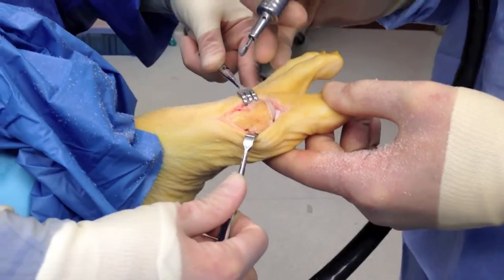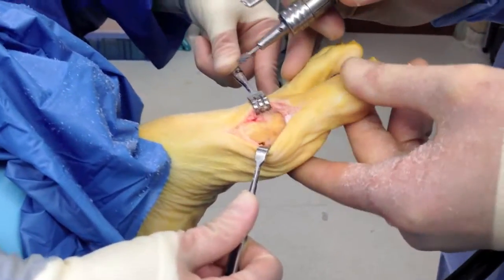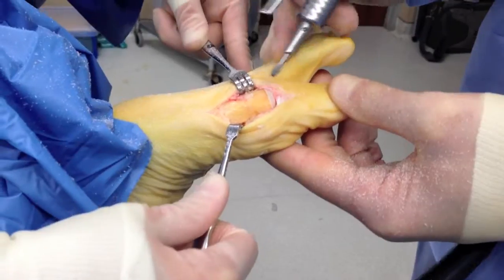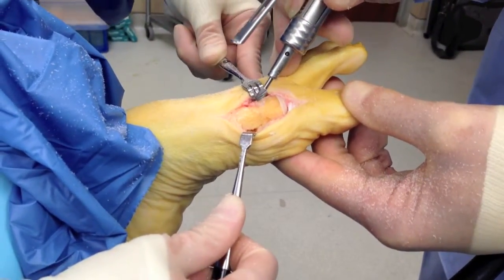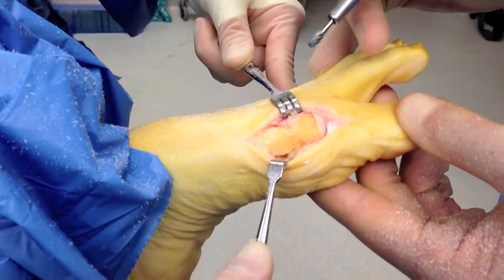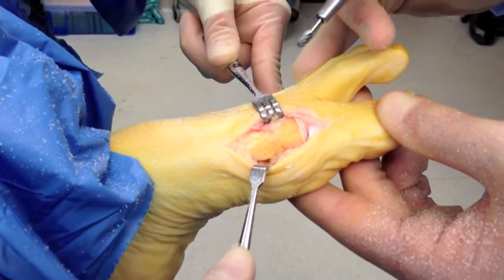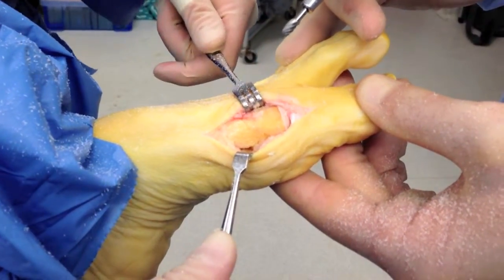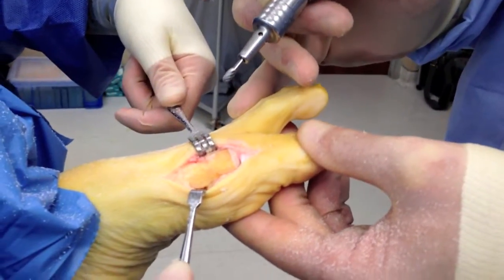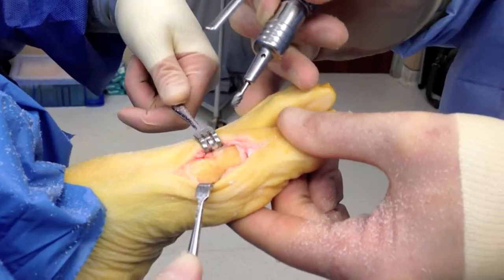Now what we have is the finished product. I've done all the burring. The osteotomy you can see is still down here, and the nails, which you can barely see, are here and here. Those will be absorbed into the bone in probably about six to eight weeks. And there you have it — an Austin bunionectomy with a Solana allograft nail.